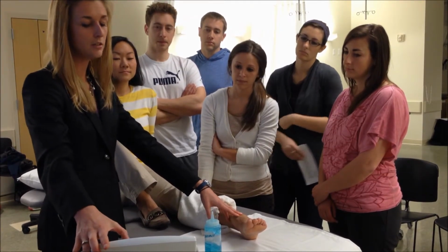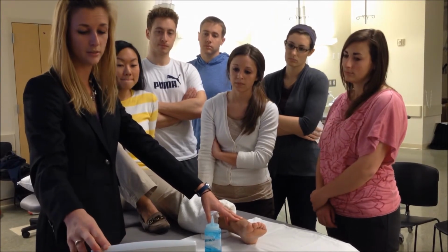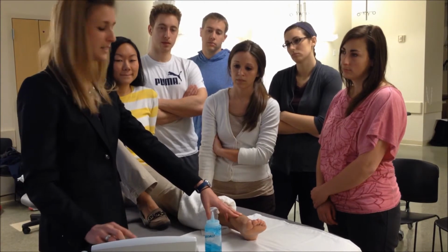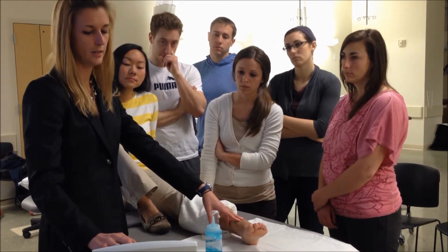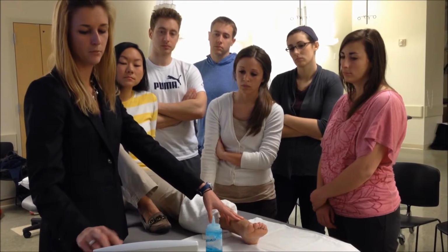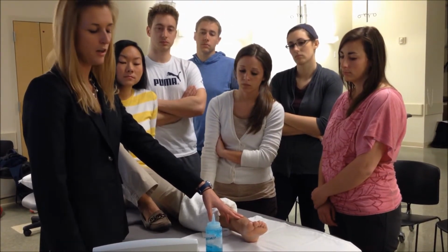Our duty cycle is 100%. We want it continuous for thermal effects, so that's okay. Now our intensity right now is at 0, so to adjust intensity we're going to turn this knob here. And again, this is based on patient tolerance, so we're going to try a 1 to start. Anywhere between 0.5 to 2 is okay. Treatment time, we're going to adjust that to 8 minutes. And we're ready to go.